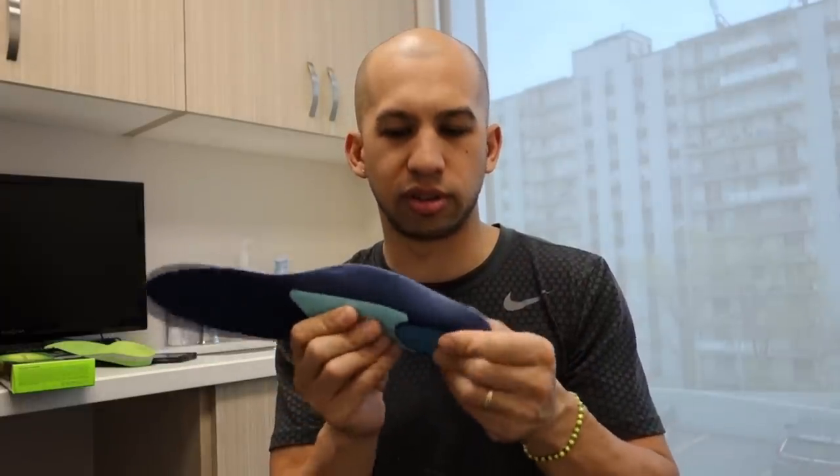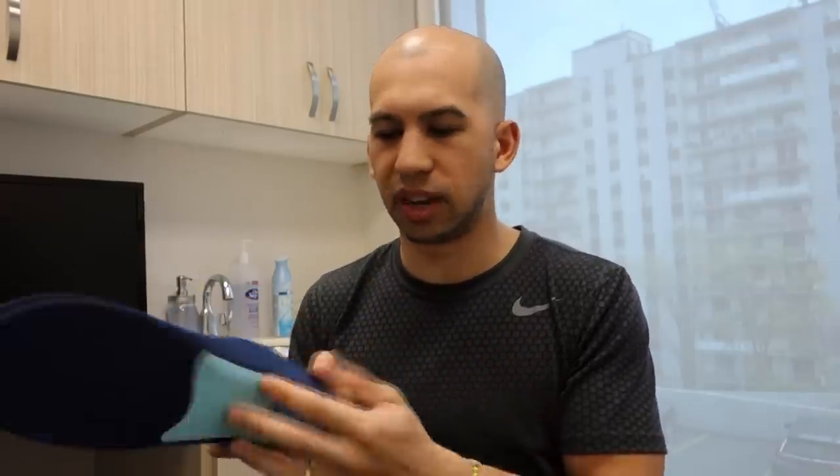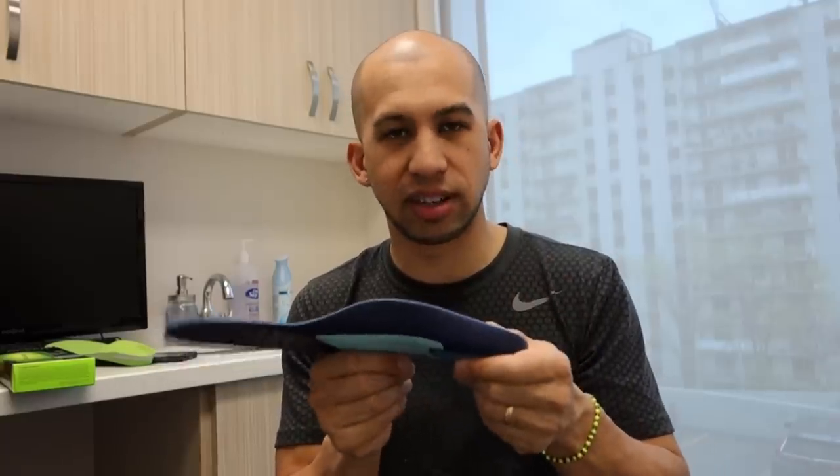This is definitely a step up from the last one — pretty comfortable. I like how it feels and how it looks. However, if you're someone who's carrying a lot of weight, this might not do the job for you and might not give you enough support, but it's definitely better than having nothing.